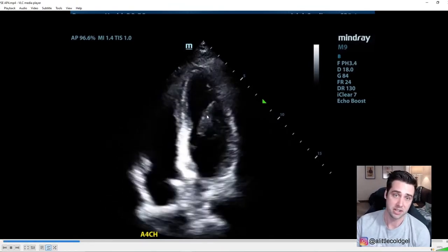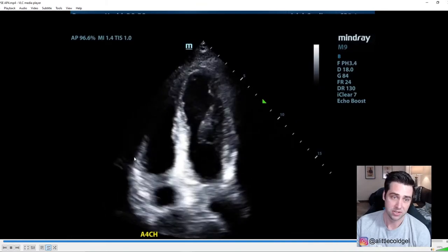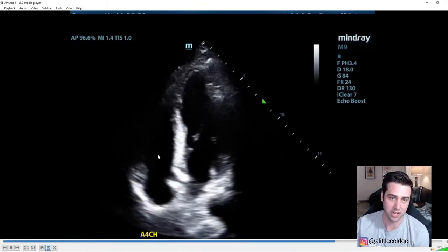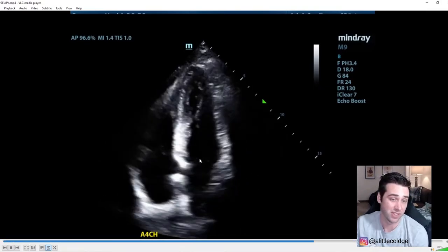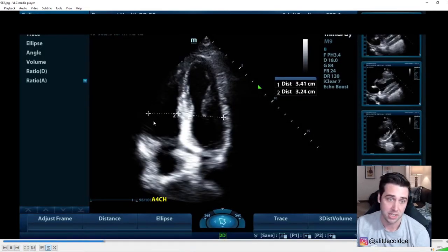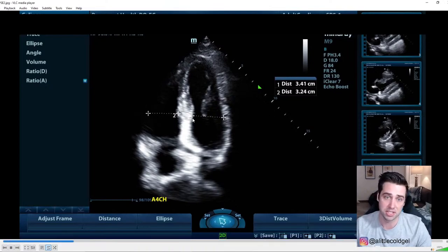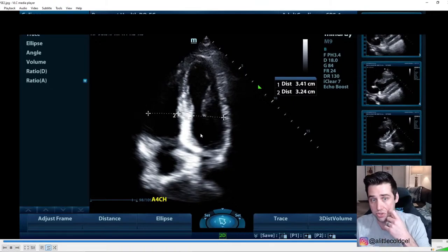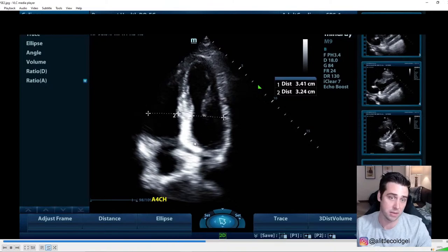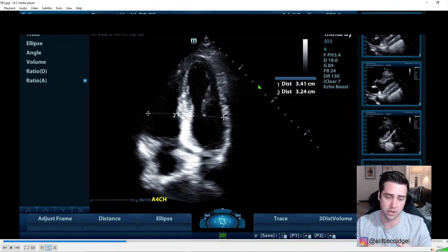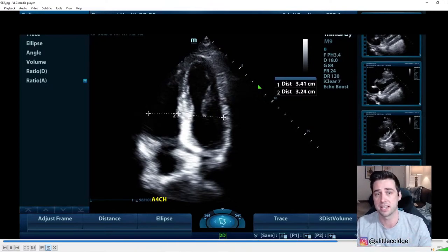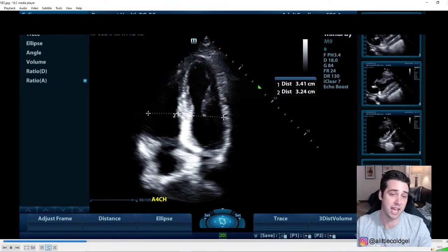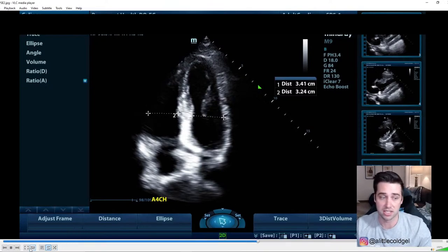Here's a more normal apical four-chamber view. Left ventricle, left atrium, right atrium, right ventricle — and the RV size looks appropriate, roughly one-to-one with the LV or smaller. When measuring RV-to-LV ratio, remember to measure mid-ventricle, not at the annulus — the cardiac trigone near the base is relatively rigid, so acute RV dilation might not show as prominently right at the base.